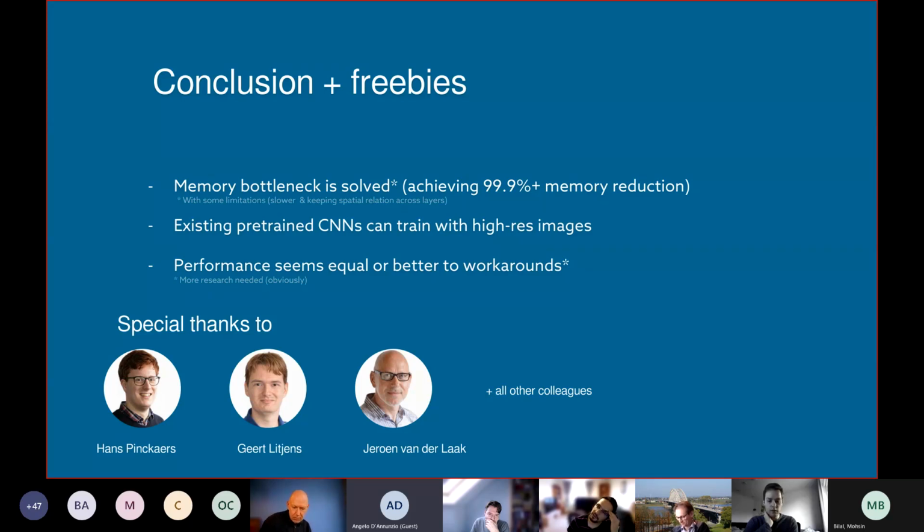I mean, even if you think of designing your model to extract robust feature representations, you can even think of flipping the image or even rotating the tiles. That shouldn't change the representation. If you want your encoder to extract robust representations, then I guess even flipping and maybe even rotation can be done on tile level. But my main question was, sorry, I interrupted you.